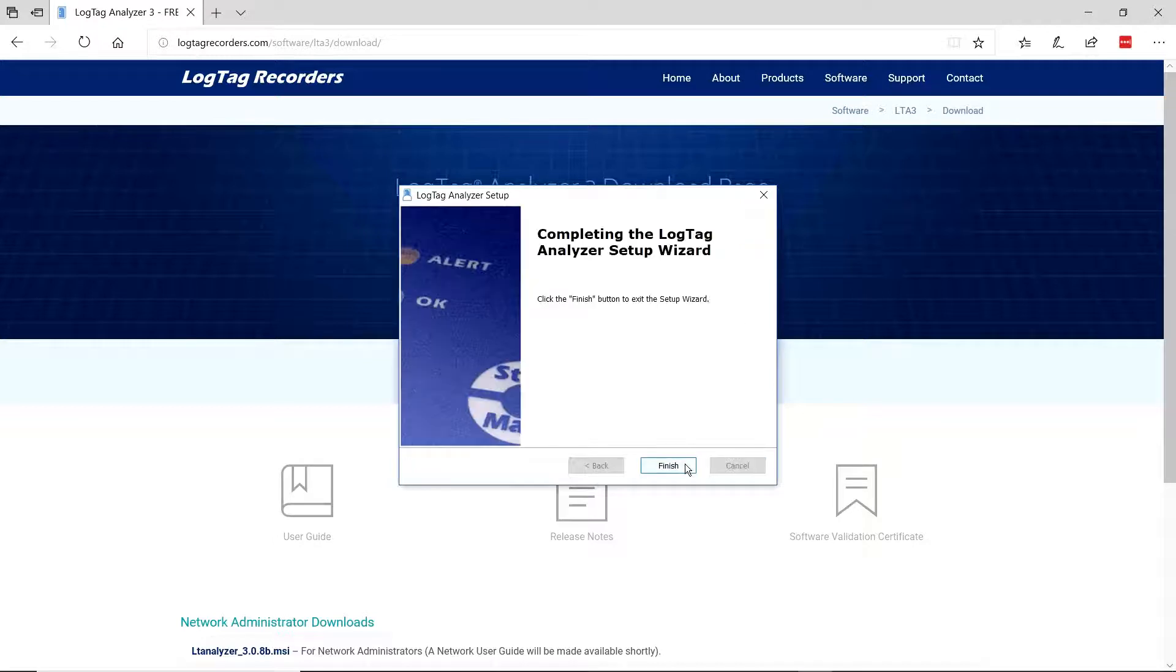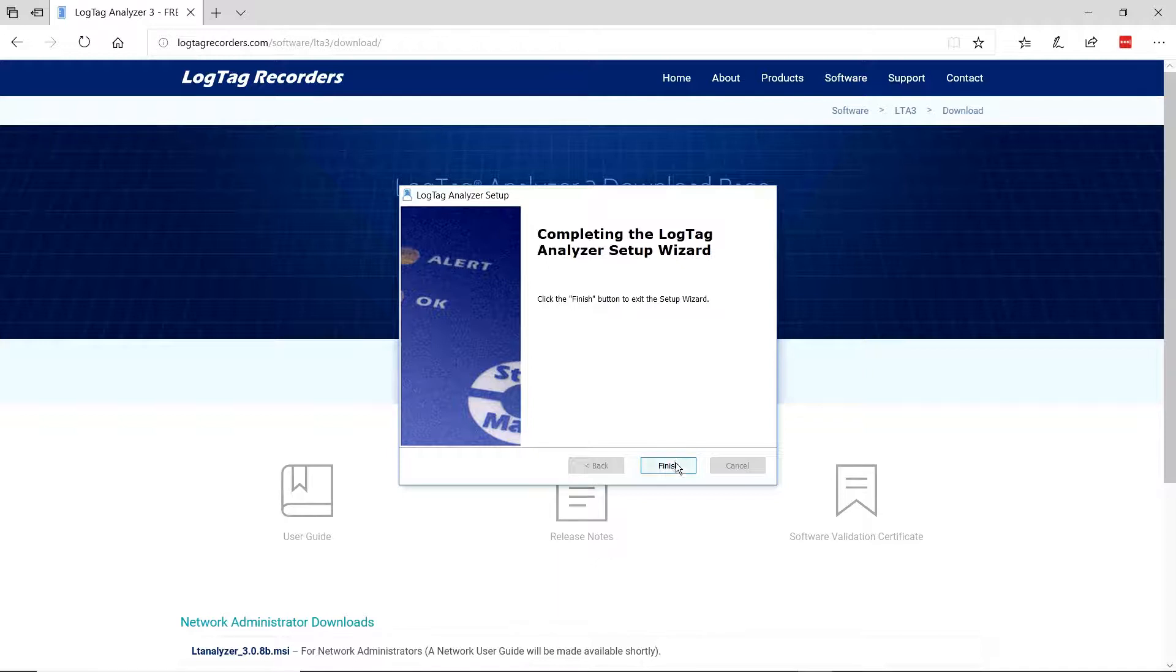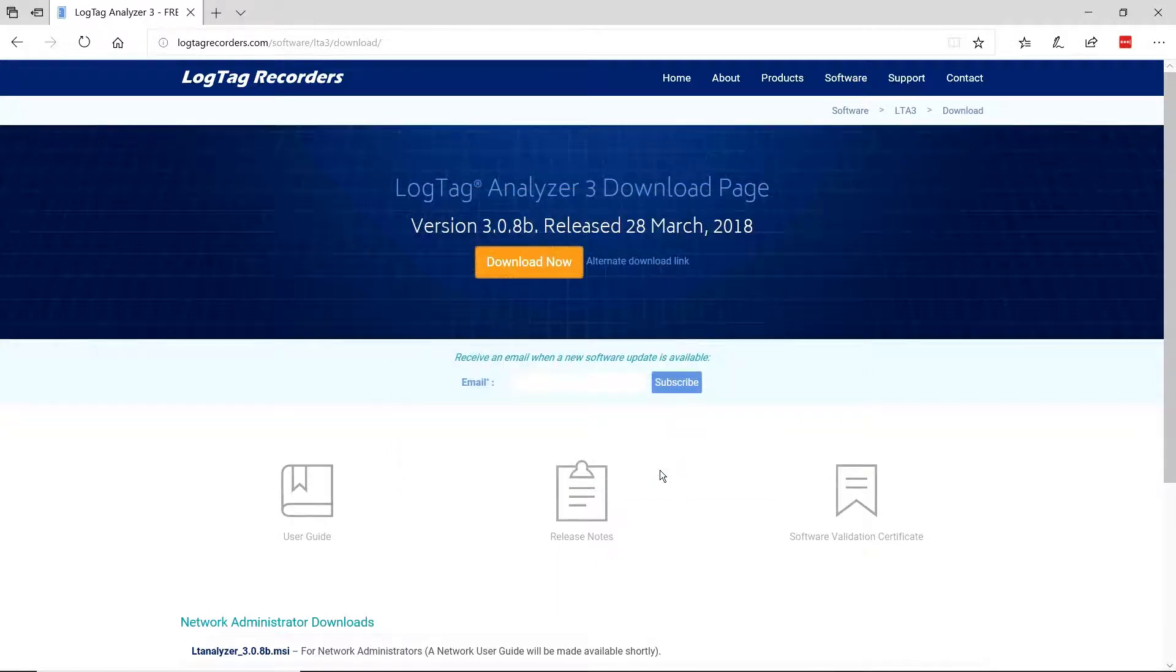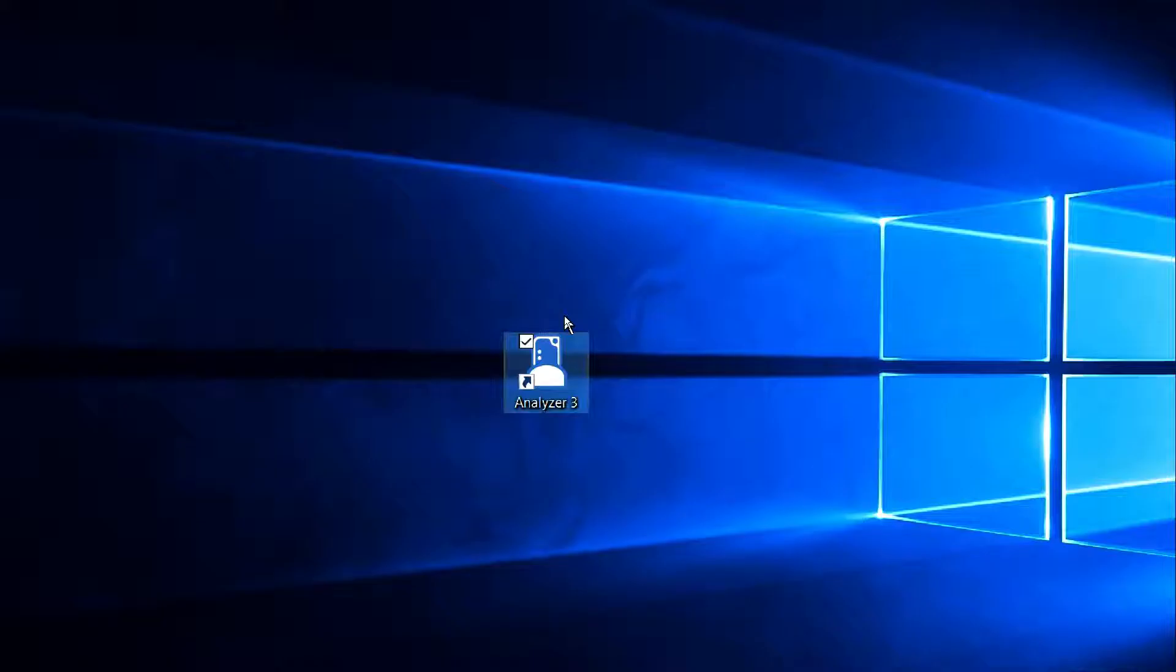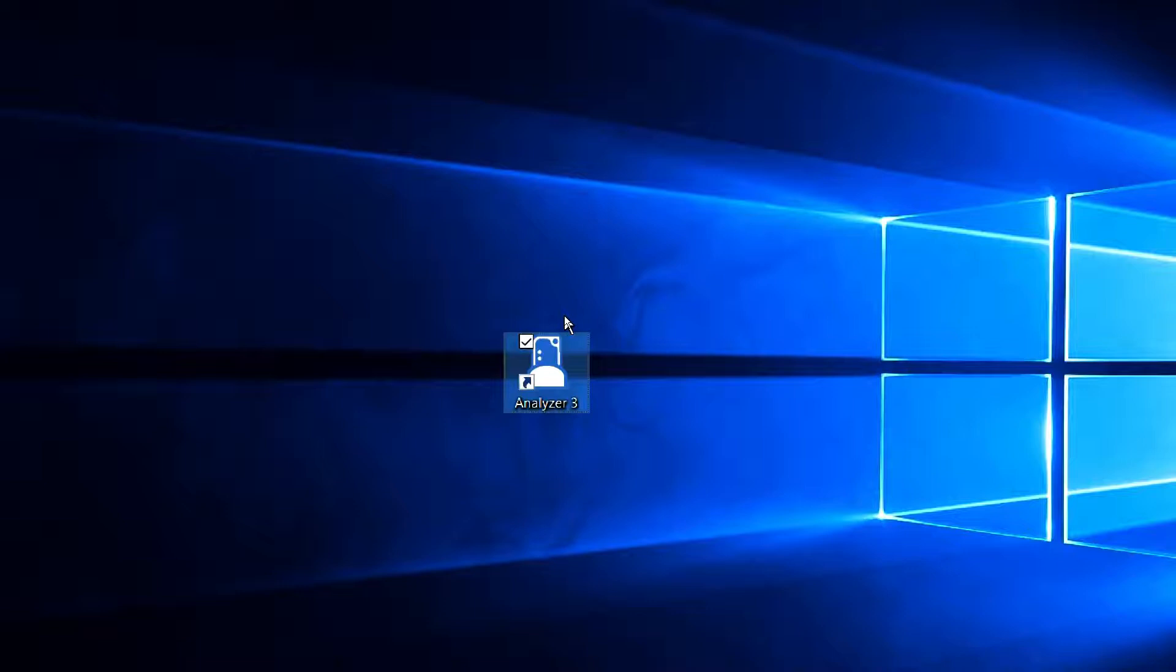Click Next. The software installation is now complete. Click the Finish button and close the Install Window. A shortcut icon will now be on the desktop for Analyzer 3 software.